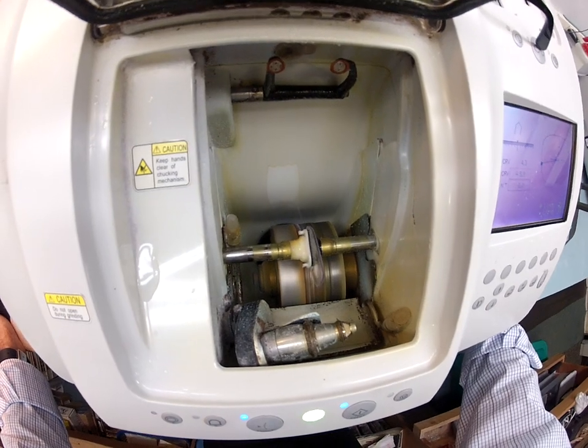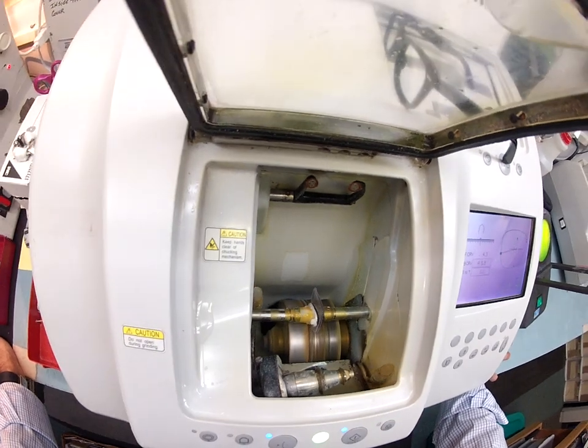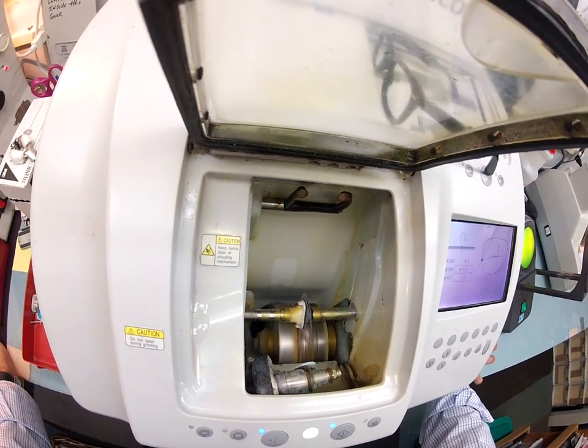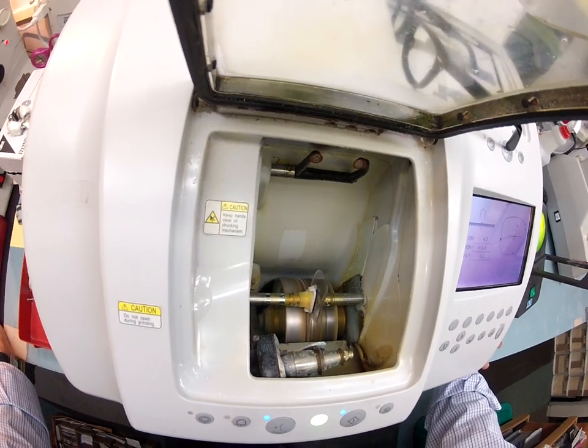The golden rule of carpentry: you can always cut more off a board, you can never add back on to it. So I start slow — once I get the size right for the right lens, I flip it over and cut the left.